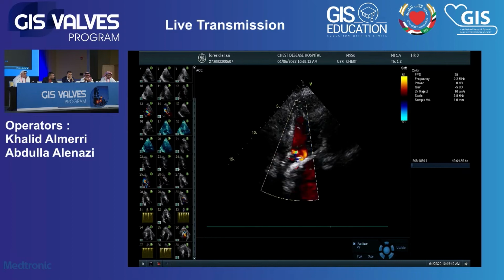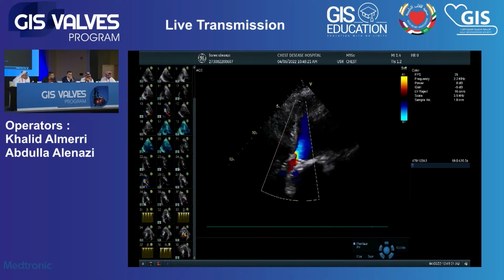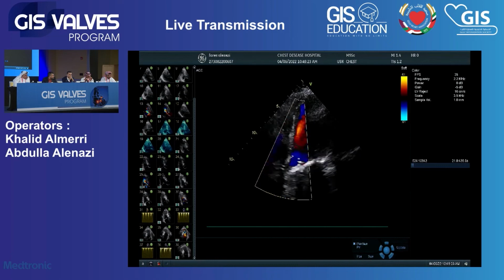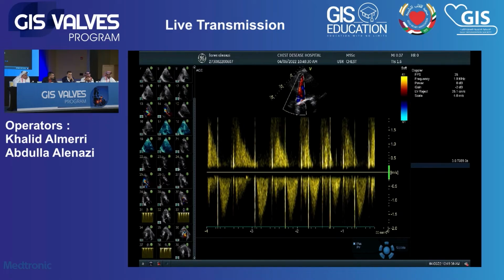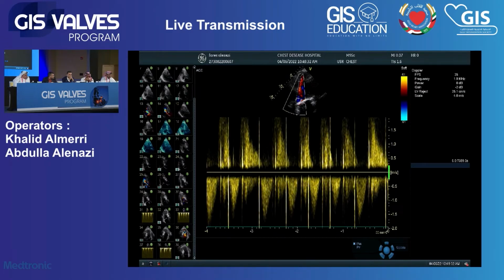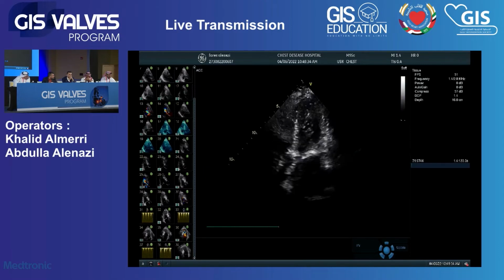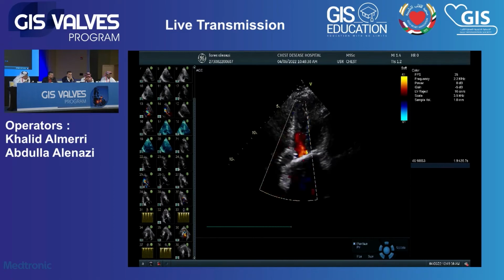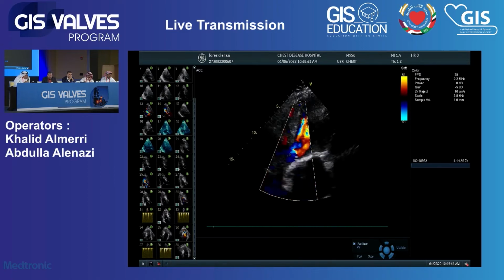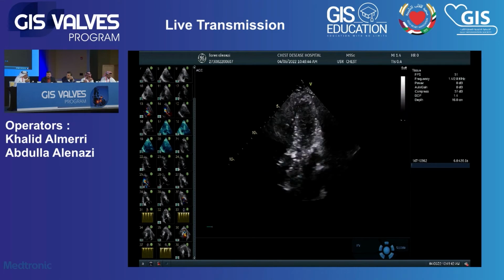Sizing: a lot of operators downsize a little bit in cases of bicuspid aortic valve. Still, there's the question of this lady: she's relatively young, and if it is a heavily calcified bicuspid aortic valve, I think, just keeping in mind the Sentinel or protection device, I think it's advisable in such cases. Yes. Well, there's no such consensus; it is still operator-dependent.